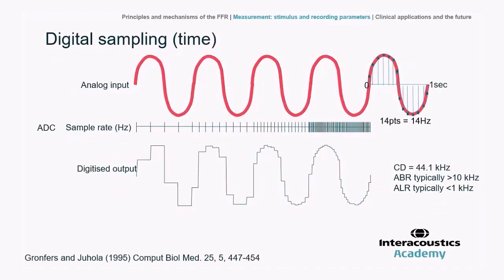Now, why about the 30 milliseconds time window? So ABR signals, like we're showing, are usually very oversampled with regards to the bandwidth of the signal. So sampling frequencies of 30 kilohertz and more are very typically used by ABR devices, but the information content of the ABR signal isn't very high above around 2 kilohertz. And so normally the lower fence for sampling rate would be double the upper level of the frequency content. So if it was a signal up to 2 kilohertz, then a sampling frequency of 4 kilohertz or higher should be sufficient, and yet we use perhaps 30 kilohertz or more. So that's what I mean by oversampled.